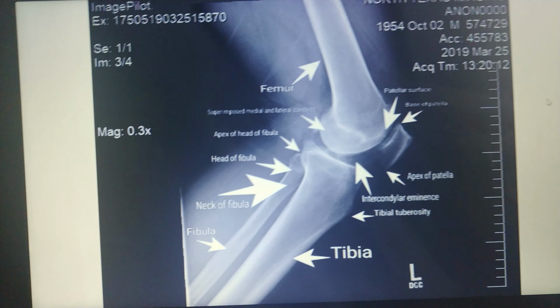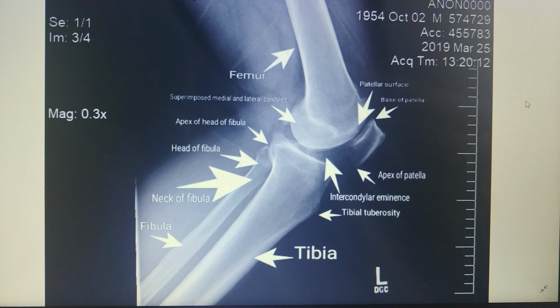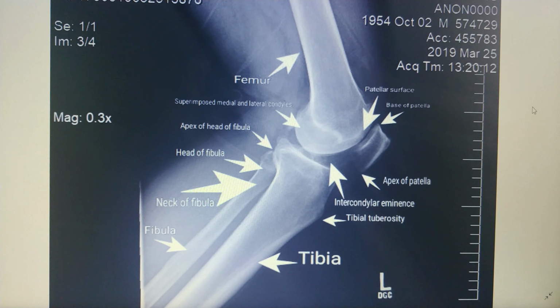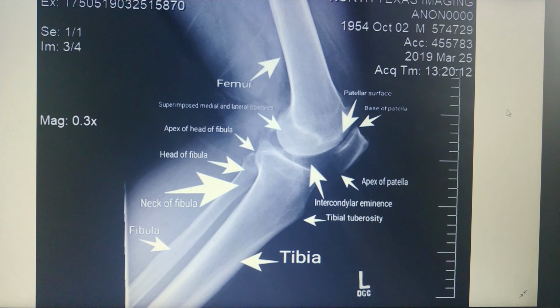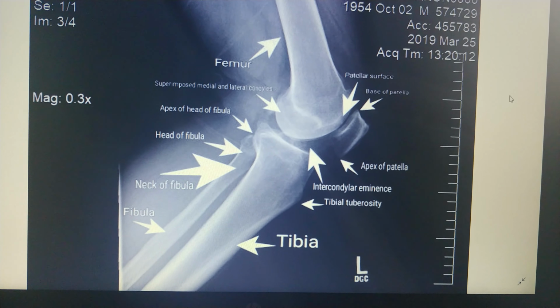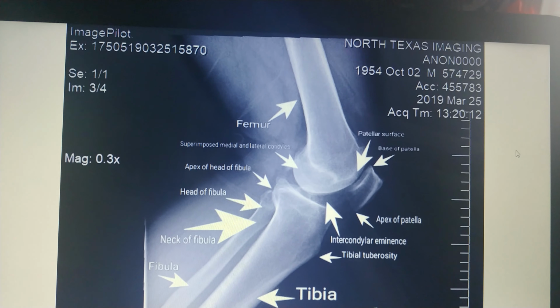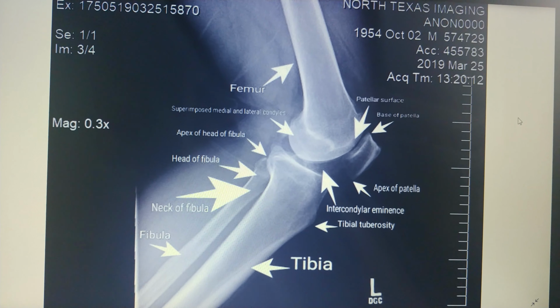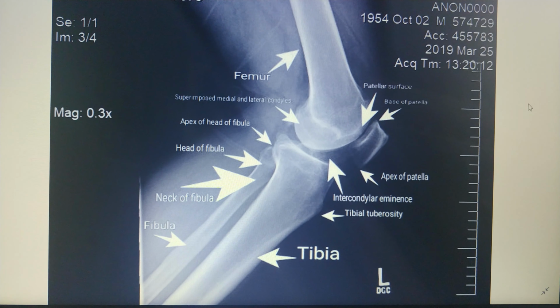sharp trabecular markings. So, as far as the picture goes, as far as corrections and things of that nature, the centering on this particular image isn't as ideal as I think it should be. I think I centered a little bit lower. It's evidenced by more than probably a distal 1/3 of the proximal tibia and fibula being shown, and less of the distal femur. So we see more of the tibia and fibula and less of the femur, and that would indicate centering lower than what I probably should have.